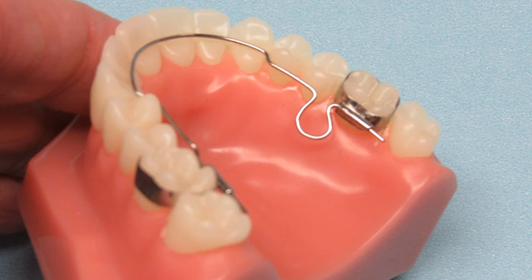The BWS works as a fixed removable appliance. The doctor can remove the appliance without having to take off the bands, activate the appliance, and then reinsert it — but the patient cannot remove the wire.